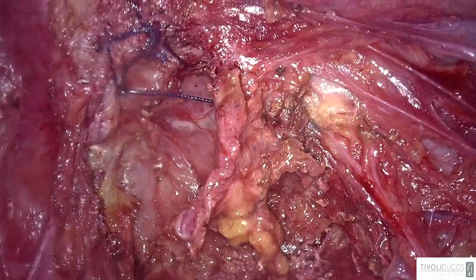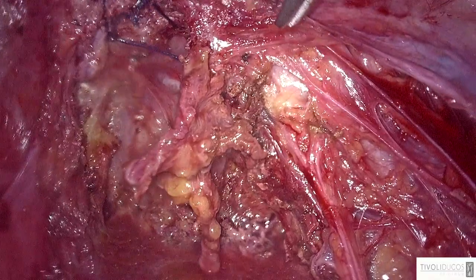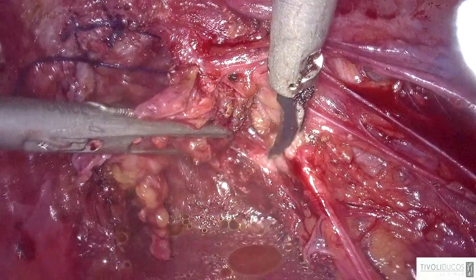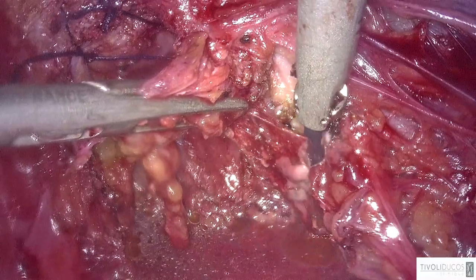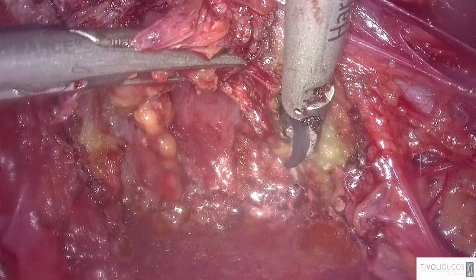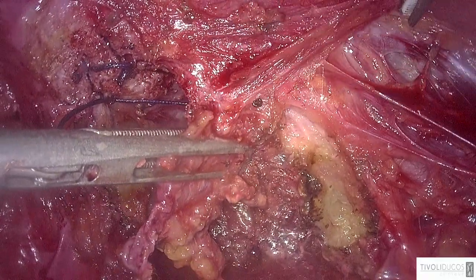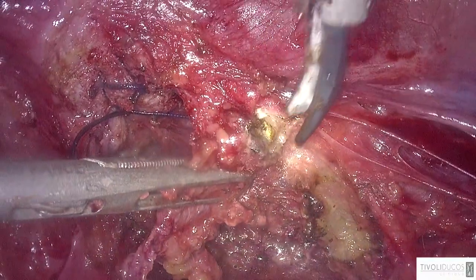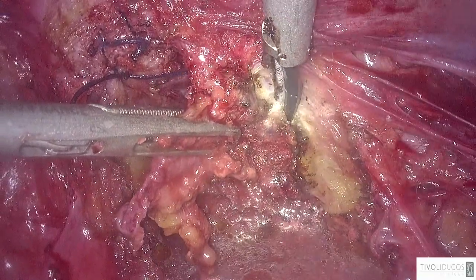So how does it work? I mean, during the operation, you are stimulating the nerves, something like that? You said it is to check the function of the nerve, right? You stimulate the nerves and you observe if there is a contraction of the bladder or of the anal sphincter. So the device includes one laparoscopic stimulator and then a pipe to be connected to the bladder catheter and another device to introduce into the rectum.